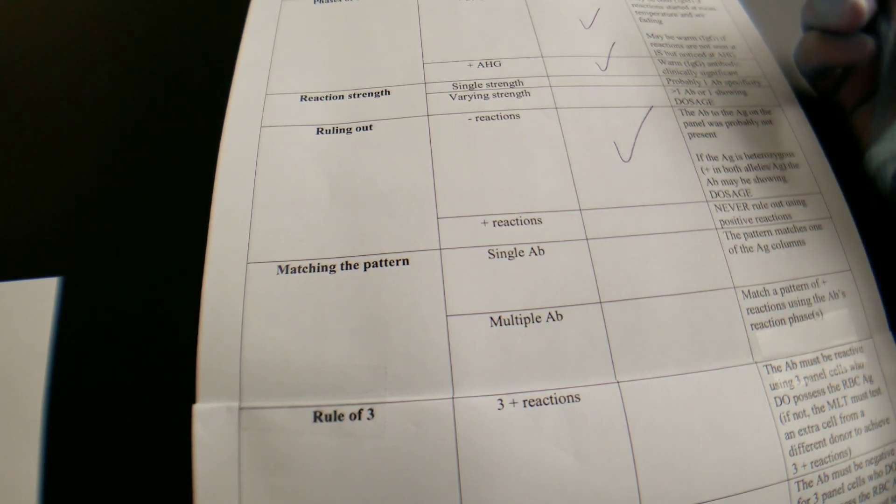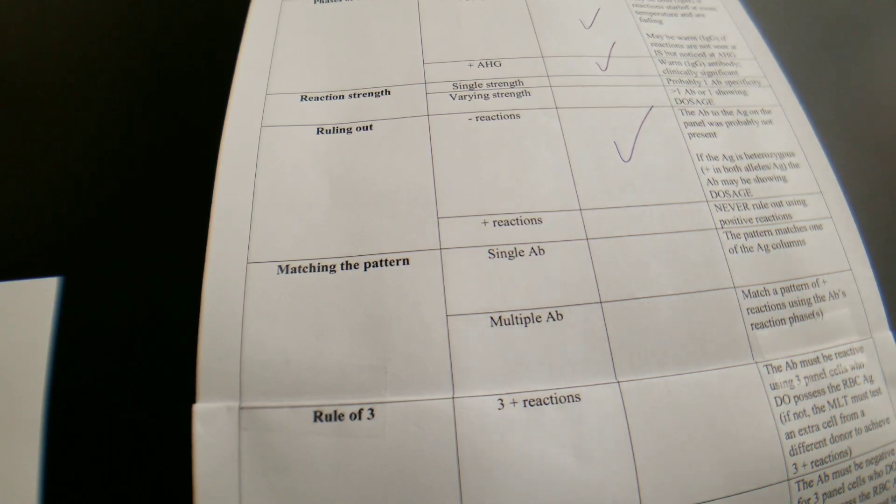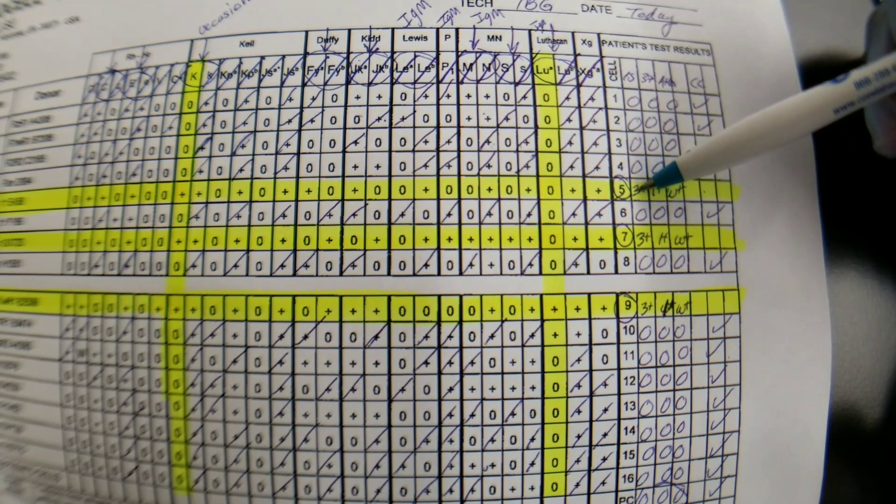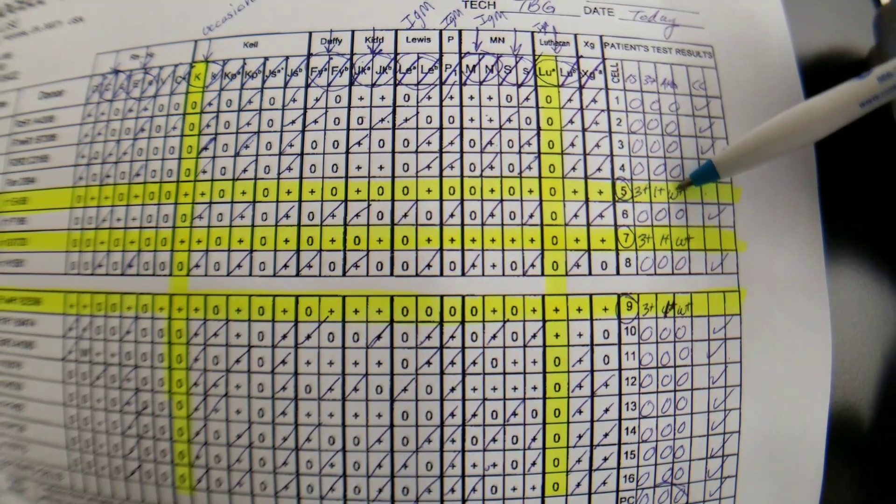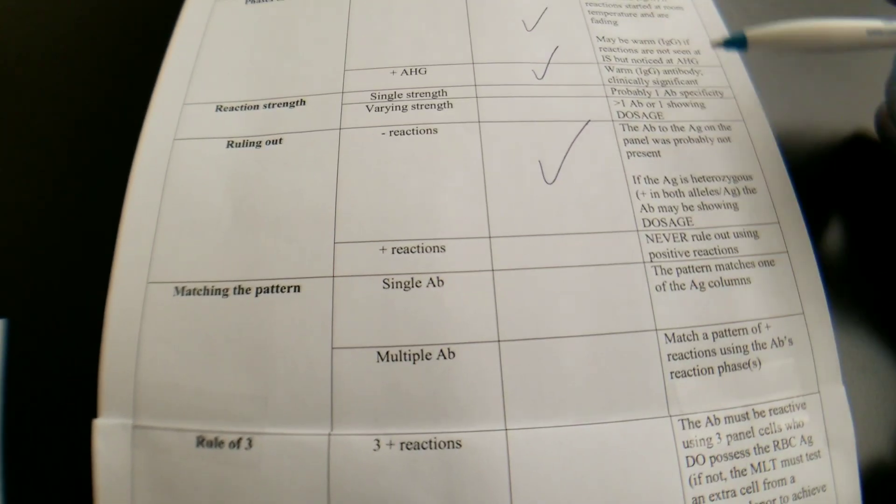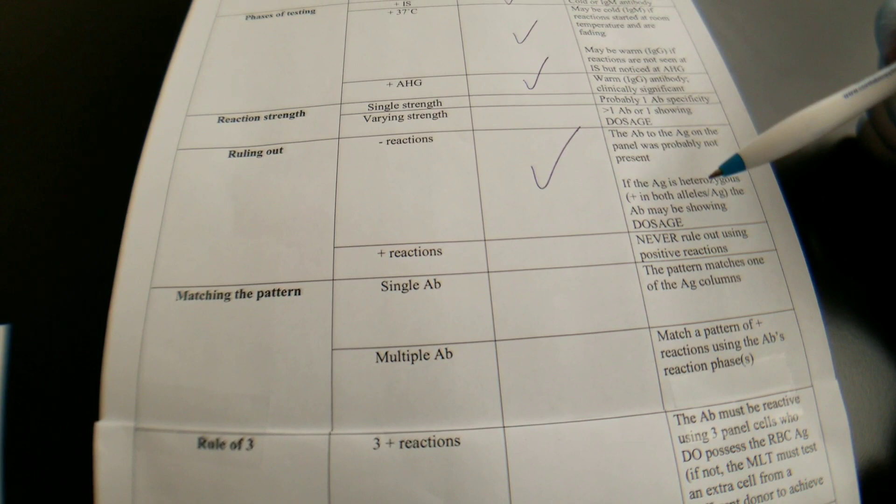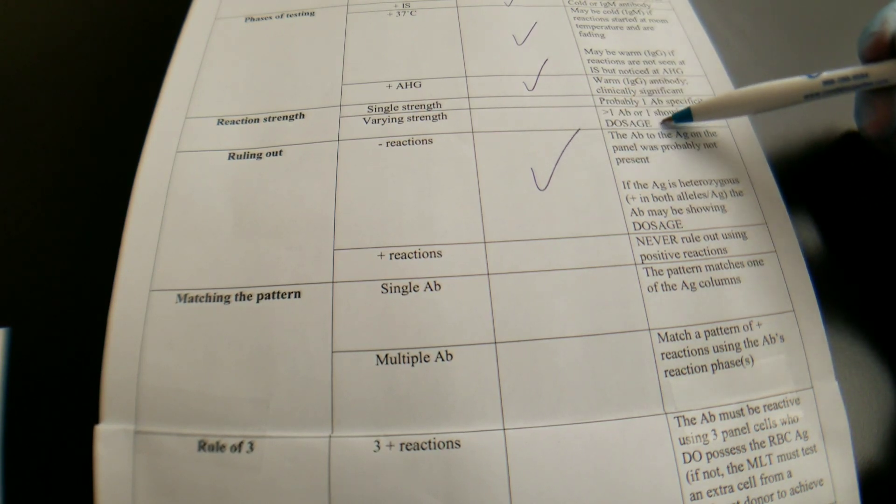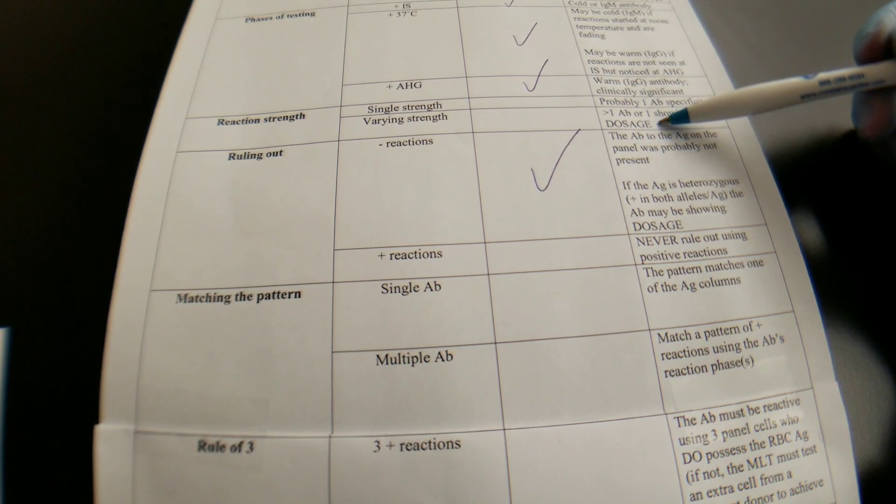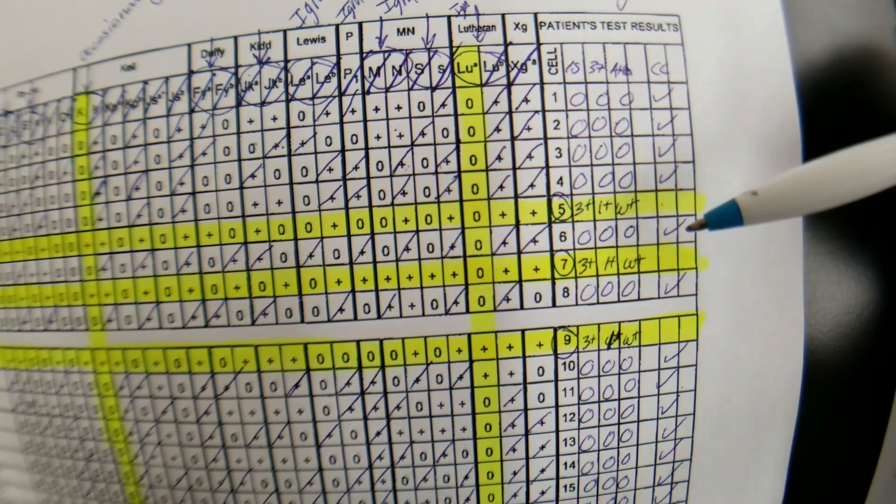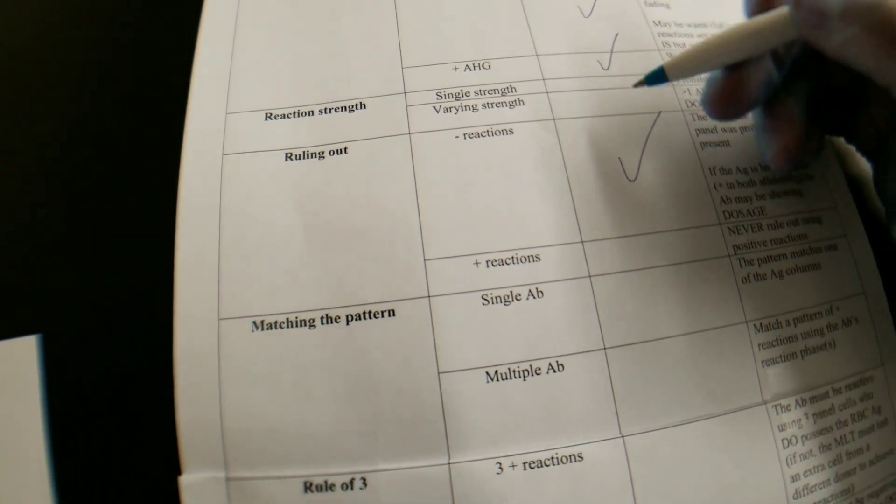The antibody that we have is showing varying strength only in that it's stronger in the immediate spin and then waning throughout the rest of the reaction phases. So the question here asking, the positive reactions, do they show varying strength or not? It does, but not in the way that it's asking here. Okay, so all of the reactions in those lines are the same strength in each phase. Okay, so we're assuming we have one antibody there.